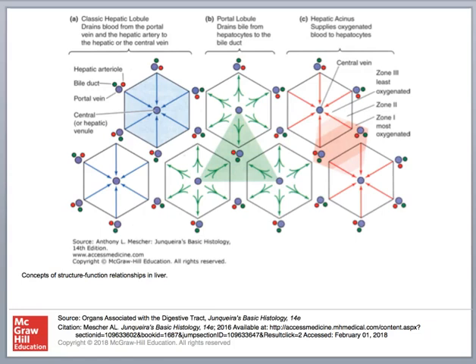The concept of portal lobules of hepatocytes is more useful when considering the exocrine function of these cells, that is, bile secretion. The portal area has the bile ductule at the center, and bile moving in the opposite direction as the blood flows towards it from the surrounding hepatocytes. The tissue draining bile into each portal duct is roughly triangular in shape, with the central veins of 3 classic lobules forming its angles. So this triangle here.